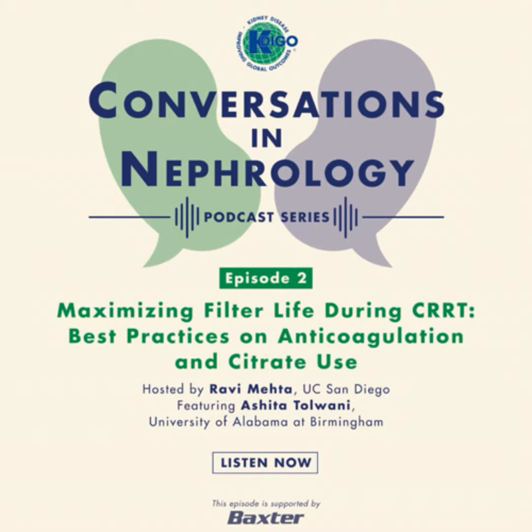Thank you for bringing out these really important elements for the circuit. Given that anticoagulation techniques are present and so variable, how do you decide which one to use? And is it really necessary to use anticoagulation? There have been described in the literature no anticoagulation protocols having effective circuit patency. And you can definitely maintain circuit patency by optimizing all those circuit factors we just talked about, like the access, the circuit issues, et cetera.